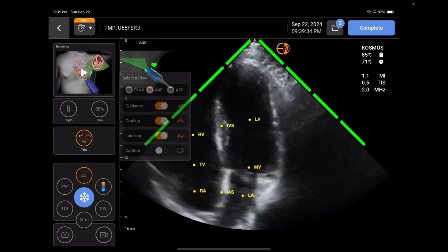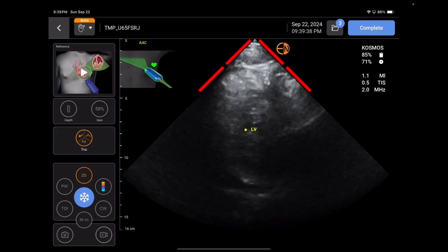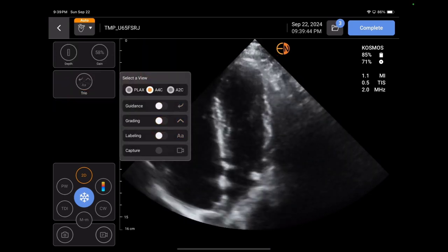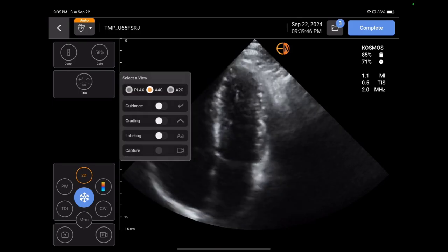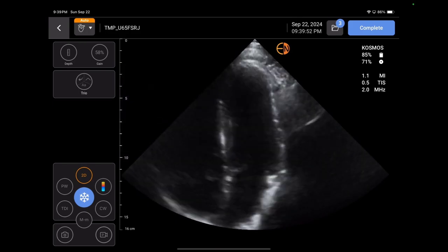There's the labeling from before — obviously it's a better image, so the labeling is easier on the machine. You can get all this stuff at once, or you can turn it off if you don't want it on the screen. You can do this again for the parasternal long, the apical four, or the apical two chamber. That's really cool.